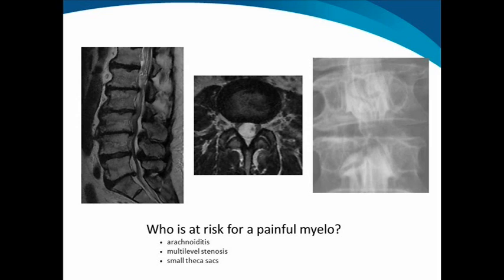the procedure can become very painful. We have nursing standing by, able to administer pain medicine if needed. Not everyone has pain with this spine appearance, but almost certainly all those who do suffer pain have this type of stenosis. And the pain does resolve. Within 10 to 15 minutes, most patients are back to their normal level of pain.